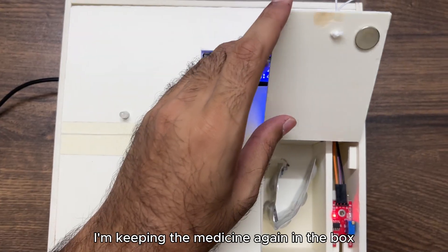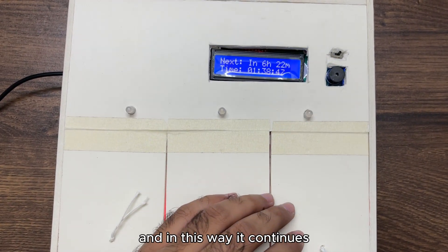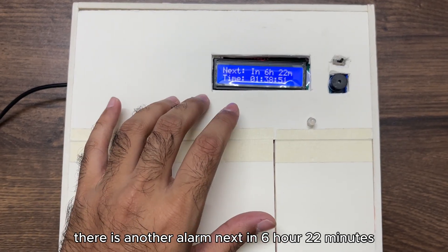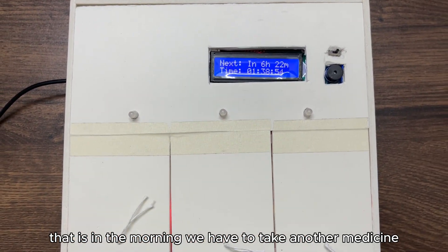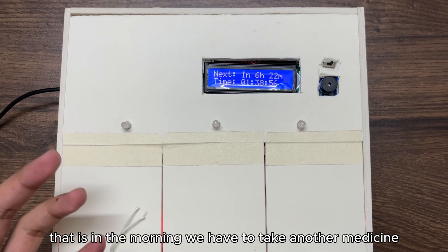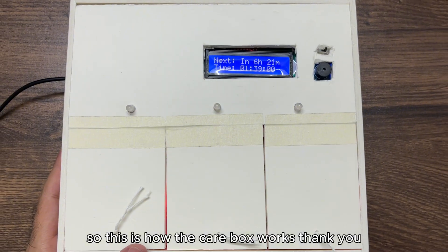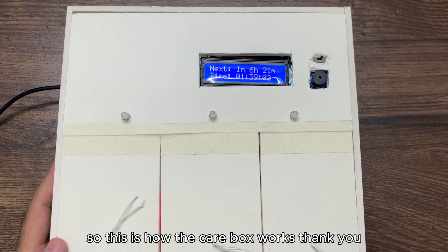In this way it continues. We can see there is another alarm next in 6 hours 22 minutes. That is in the morning we have to take another medicine and this is showing in the schedule. This is how the Care Box works. Thank you.